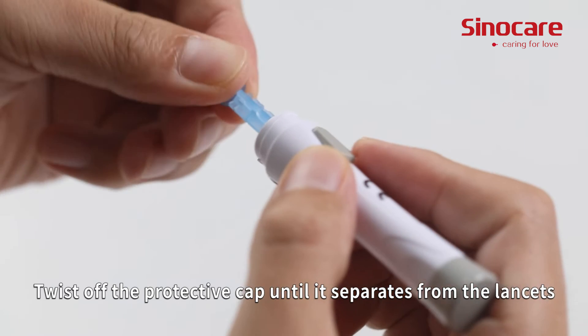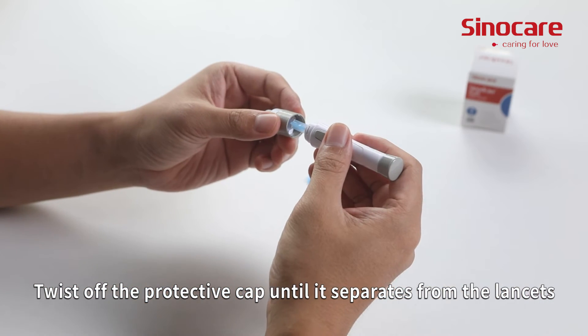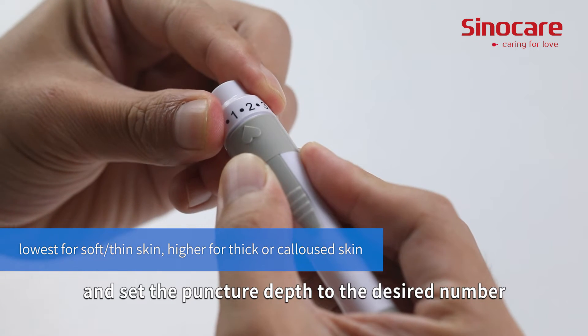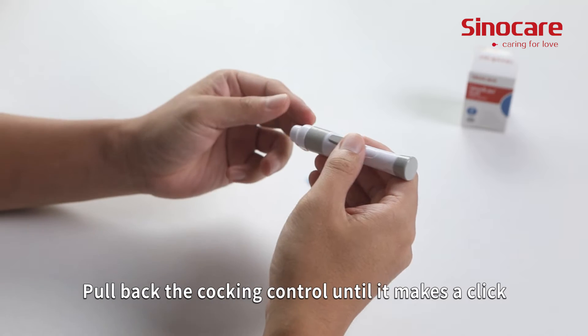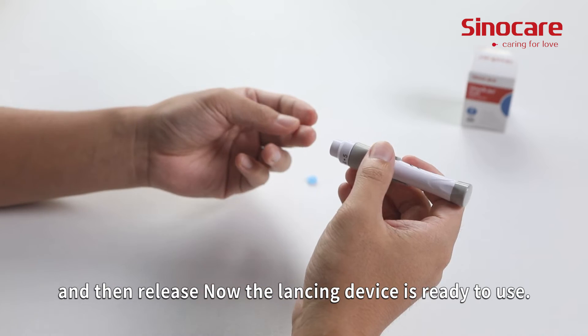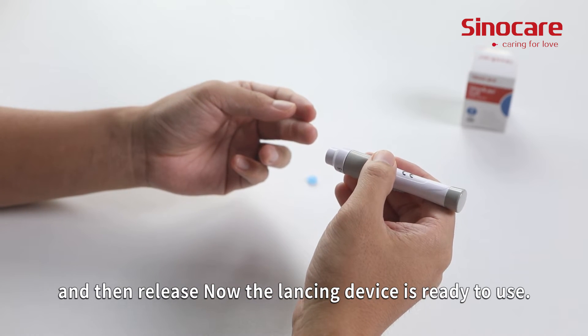Twist off the protective cap until it separates from the lancet. Replace the lancing device cap and set the puncture depth to the desired number. Pull back the cocking control until it makes a click, and then release. Now the lancing device is ready to use.